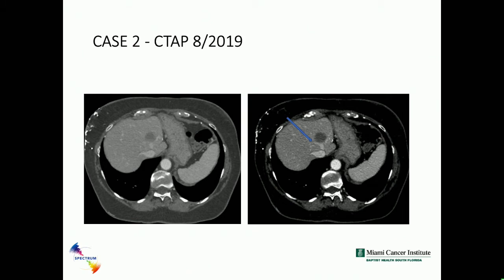Here's another example of a patient with some long-term follow-up. The patient had microwave ablation of another lesion. Again, I'll touch upon microwave ablation towards the end. This particular lesion was seen at the crux of the veins. One of the limitations of thermal techniques such as RFA and microwave is when you have the tumor right next to a major blood vessel, you also have the factor called the heat sink, where the flowing blood in the vessels steals some of the heat, and thereby the part of the tumor close to the vessel is not completely ablated. With EHE, you also have the problem of the tumor being propagated along the veins. So in this particular case, we chose to use IRE. Next slide.